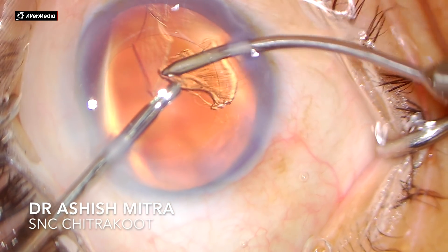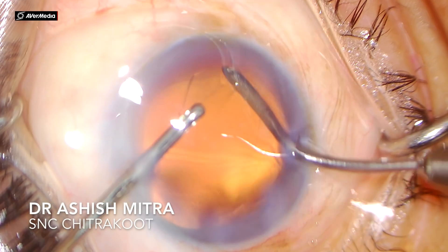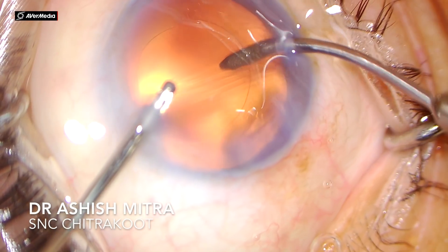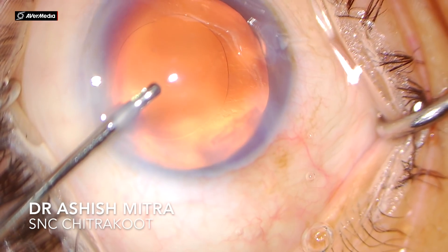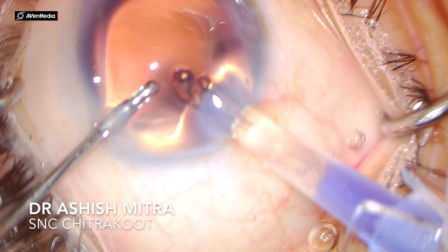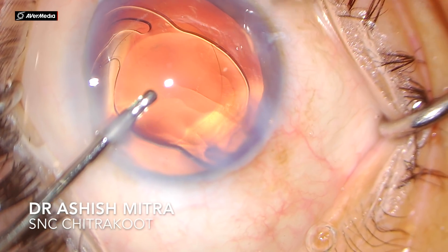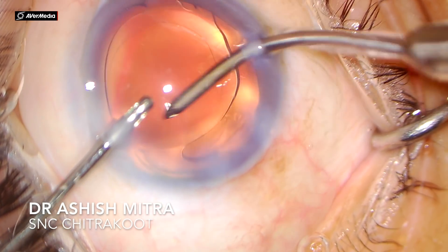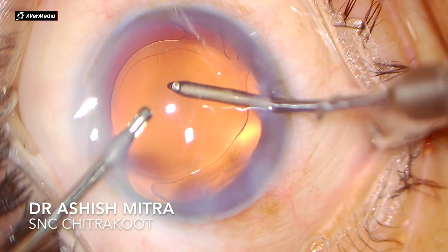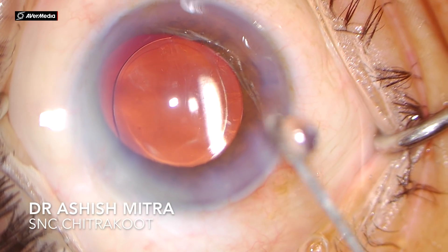Once irrigation and aspiration was done, the IOL was implanted using the hydro implantation technique. I get queries about whether it is safe — hydro implantation is very easy and safe. Whatever viscoelastic you inject, it gets out through the side port. The only issue is with hydrophobic IOLs because they unfold slowly, so one has to be careful. With hydrophilic IOLs it is very easy — you can deposit it with the aspiration cannula. For hydrophobic IOLs, you may require a dialer to deposit it inside the bag.